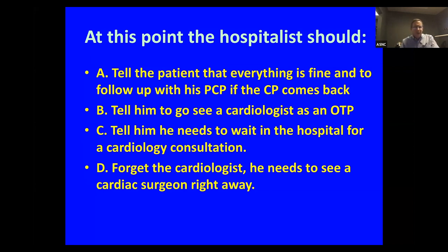Everybody says C. Everyone says C, yeah. I'd say A might not be unreasonable, but certainly A is not correct, and that can happen. When there's discordant data between the static perfusion and the CT or the flows, I found that the average internist, the average nurse practitioner kind of defaults to the static perfusion. And so I use this case to change my practice.